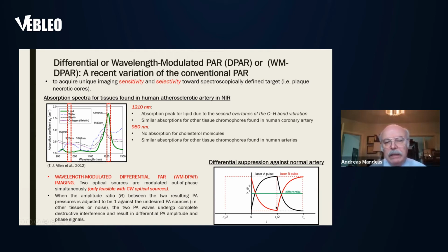So they're opposite. They're operating 180 degrees out of each other. So the signals are automatically subtracting from each other. And you're getting a good quantitative idea of what the height of the lipid peak is, which is what you'd like to have. You'd like to have a quantitative spectroscopy, quantitative imaging of how much plaque you have on the wall of the artery. This is how this thing is working.